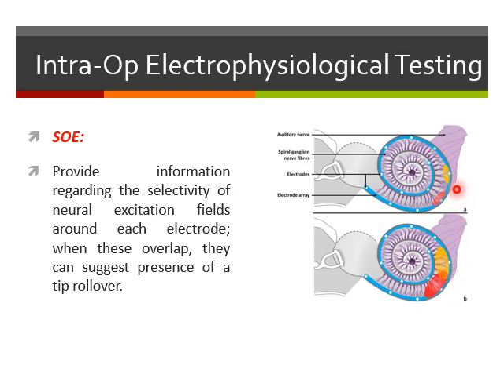Okay, the propagation of the electrical field may overlap between 2 electrodes, as we can see here. This is the propagated electrical field of one electrode. The red color represents the propagated electrical field of the other electrode, and here the orange area represents the area of overlap between both electrodes.